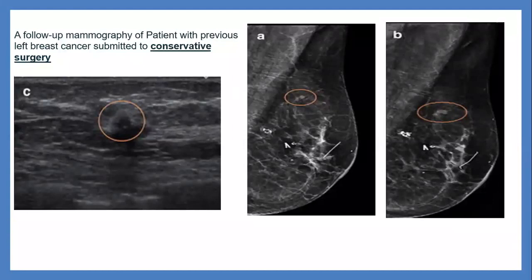Ultrasound for the newest or the previous? This is the same patient, both after surgery.